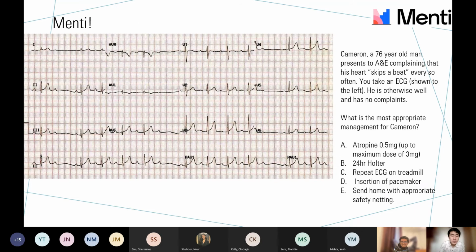Okay, another Menti. Another mean question, but if you can get your way through the reasoning or identify what's going on here, then you should be very proud of yourselves. I was just in a terrible mood when I wrote these questions. I'm sorry. I'd argue that this is quite classic. This is quite a classic ECG question. Good. Okay, fab. But you can still feel fine if you don't get it.